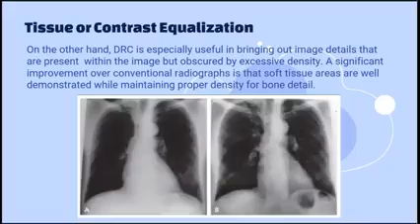Then we have the DRT function, which selects one of 20 types of software filters to be applied to the image or set of data. And we have the DRE function that sets the level of enhancement, so the strength of the filter, like on Instagram, how strong a filter you put on the image.